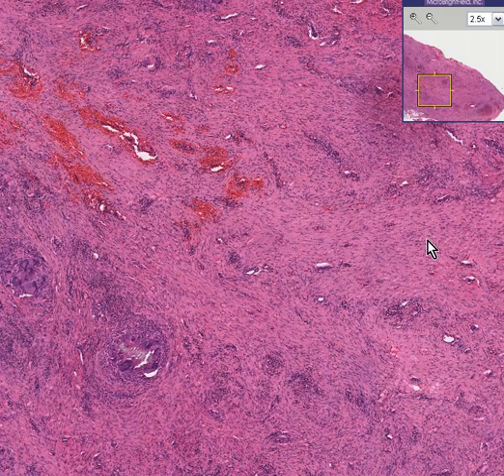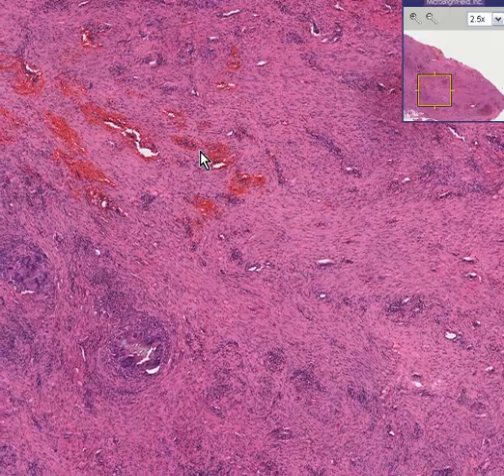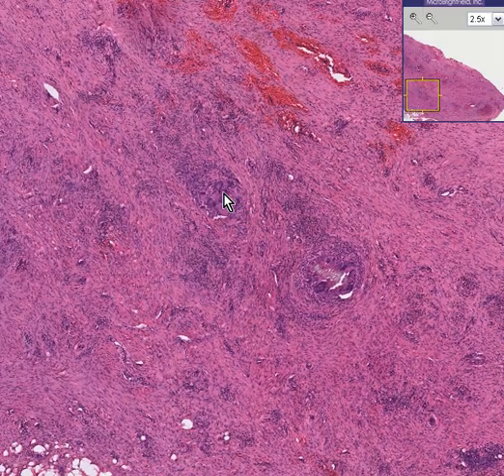So here's basically chiefly fibroblasts and collagen. Here's some blood vessels. Here's some areas of inflammatory cells.